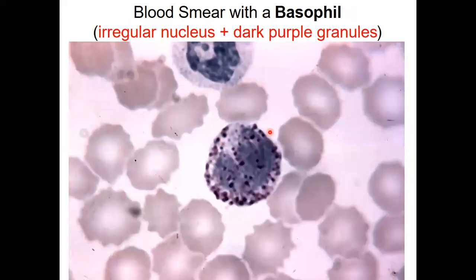Next, identify a basophil. Now, basophils are very difficult to identify in common stain. Now, this was focused directly on a basophil, but if you're given a microscope, sometimes it becomes a bit difficult to isolate a basophil. Nevertheless, a basophil is also, some books will say bilobed, but the nucleus is irregular. So it seems as if it is a bilobed nucleus. The other thing is that the nucleus is very difficult to identify because the cytoplasm is filled with basophilic granules, and these granules occlude. They almost blur the nucleus, so that you can't see exactly the shape of the nucleus.